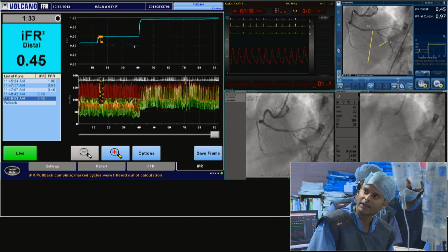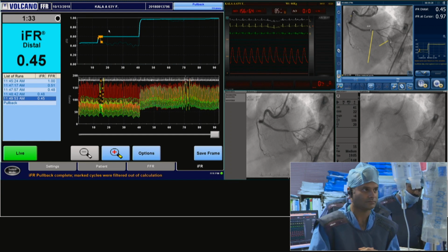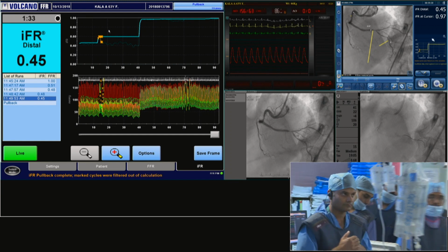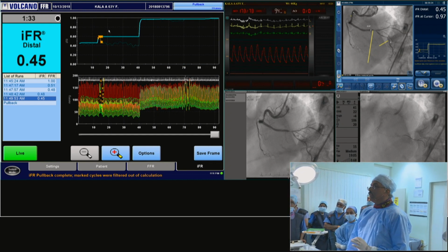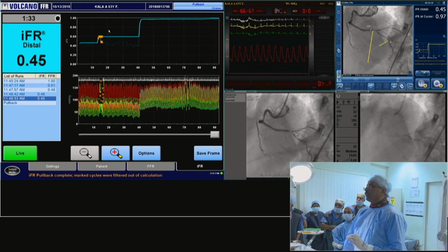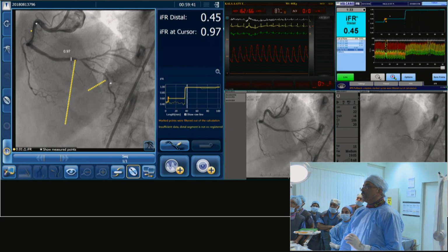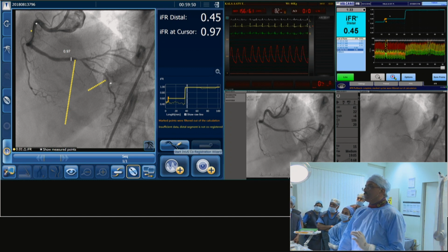The question is, can we accurately map this hemodynamic data onto an angiogram? I think that's our next step. So basically, the distal lesion in the PDA has a small jump of about 13, and then you have a big jump at the bifurcation, and the major jump is that you can see the dots now. Can you see the dots? The dots suggest the severity of the gradients.